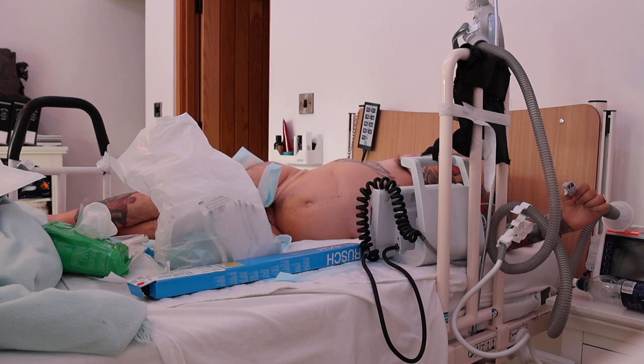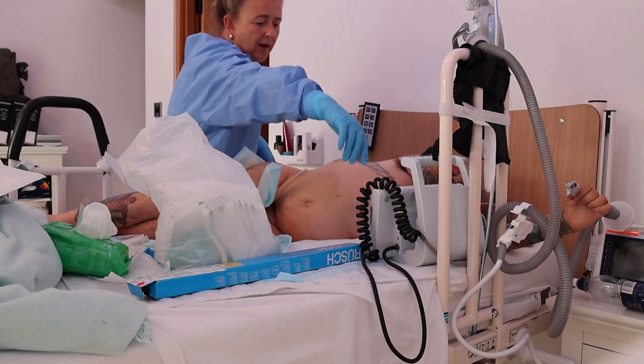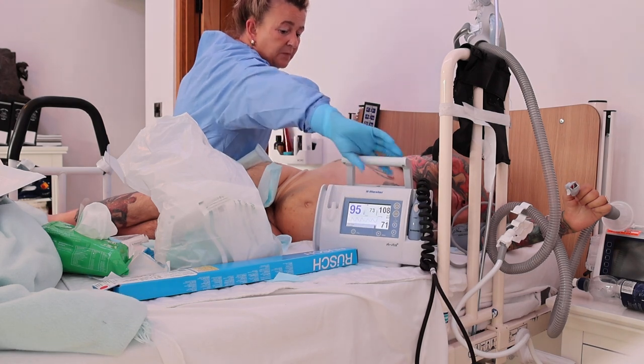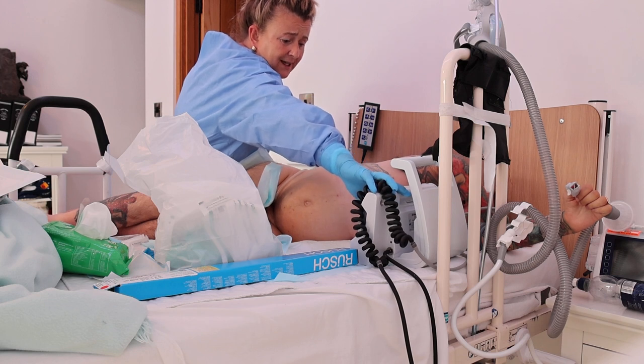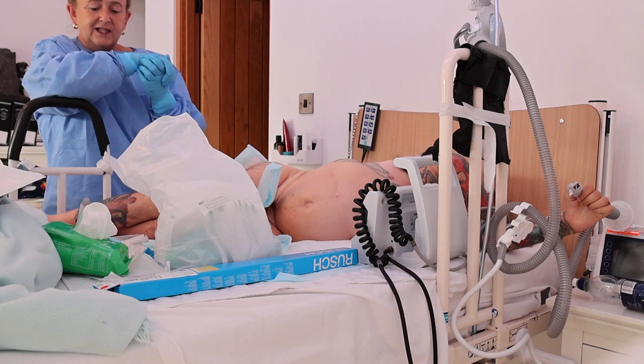So he's on antibiotics, and because he doesn't like being the way he is, I've decided to go straight in for a catheter change, no messing about. I've got my whole emergency kit ready, and I'm just about to start. I have a BP reading of 108/71 and his sats are 96, so I know he's perfect. I've got emergency drugs ready. I'm just going to take the second reading, and then we'll go from there.